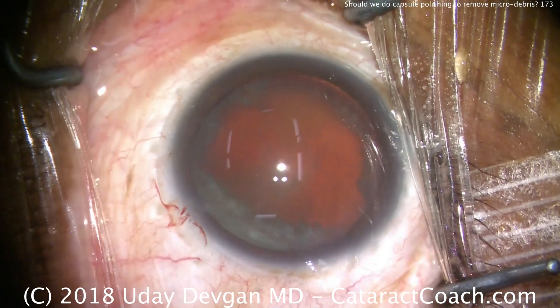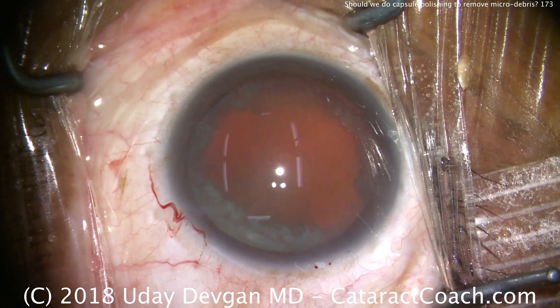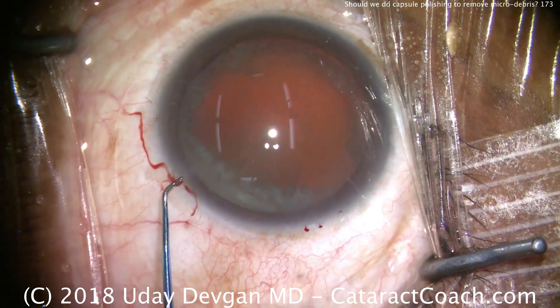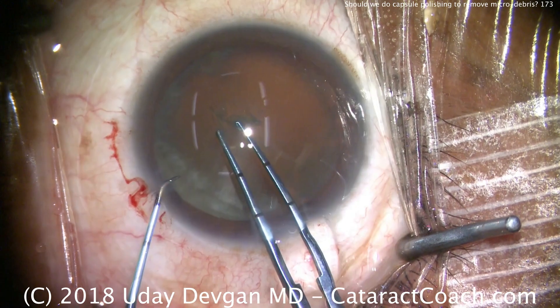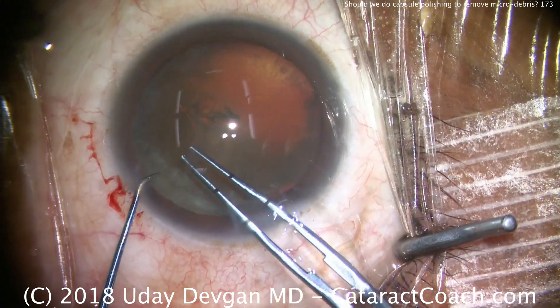We're starting off with this case. I've enhanced the red reflex dramatically because the cataract is the type that causes all this opacity. You can see here in the periphery of the lens — I'm going to use the chopper to fixate the eye and hold it — but there's not the best red reflex, because there's a lot of cortical opacity, especially in the area where I'm going to do the rhexis.